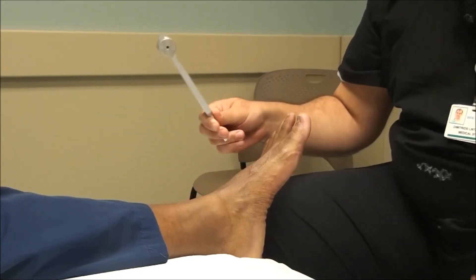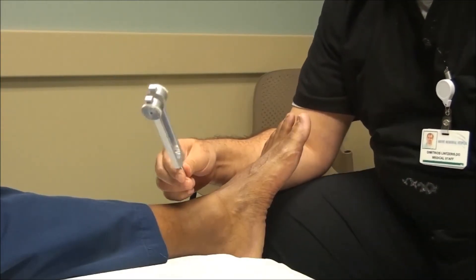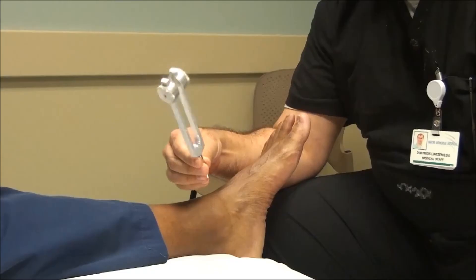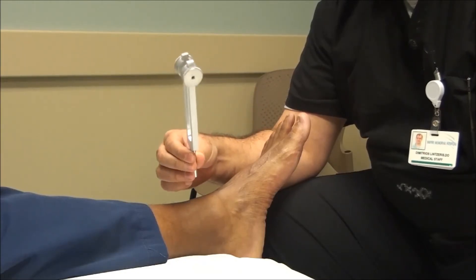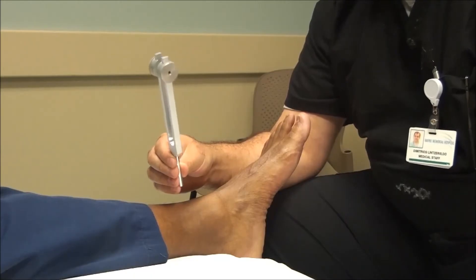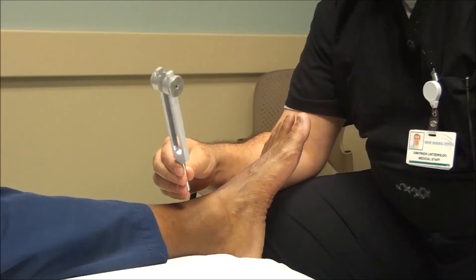The test is very easy to perform. What you want to do is start vibrating the tuning fork by hitting it against the palm of your hand, hard enough that it vibrates on its own for about 30 to 40 seconds at a time. You don't want to hit it much harder than that. Before you start the test you want the patient to understand the sensation of vibration, so we'll typically apply it either to the sternum or the arm, just so that they understand what the vibration feels like.